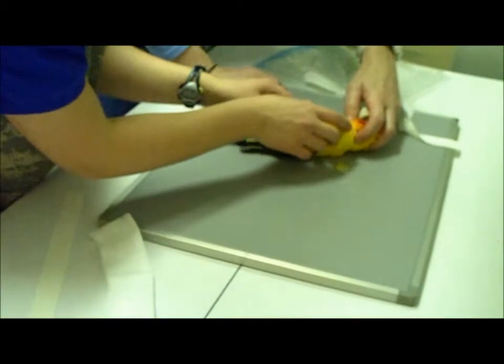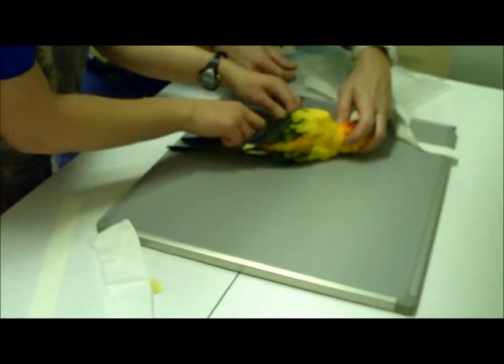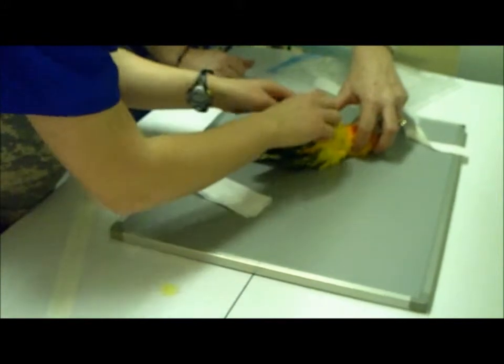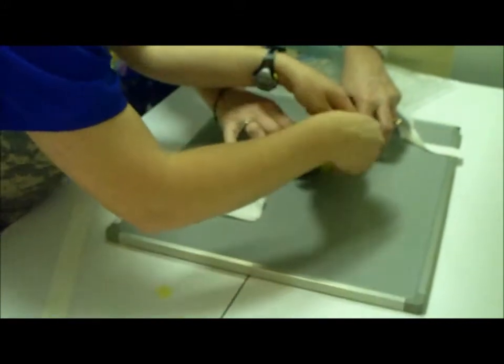The collimation is very important when working with birds; however, it is hard to do since they're all kind of one overall view instead of looking at one particular piece of the bird.